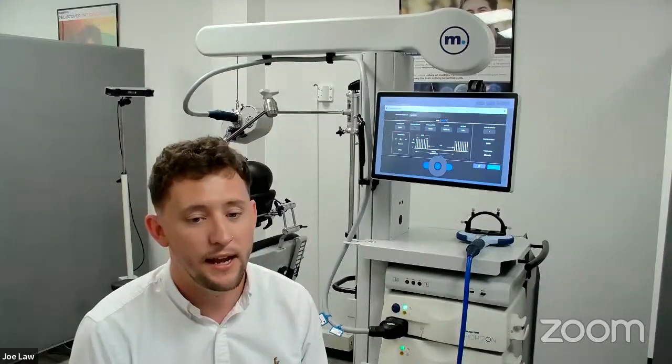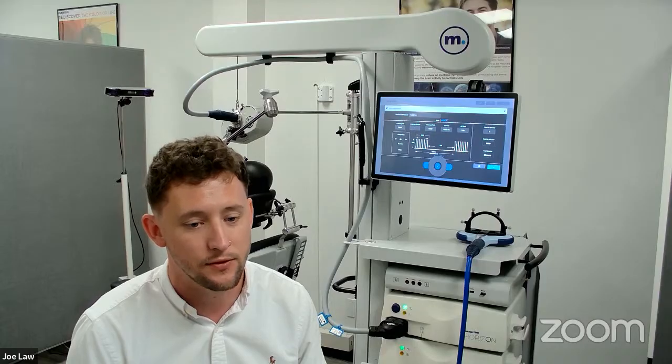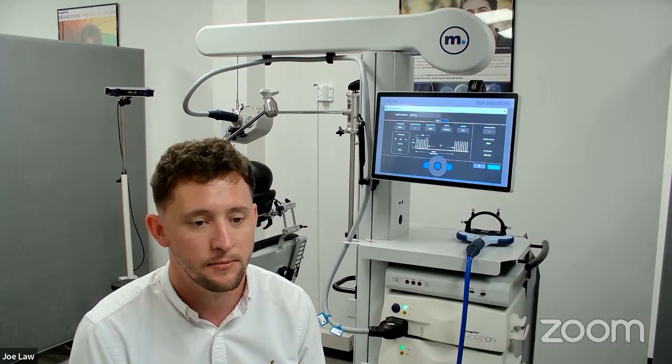We have time for one more question, team. Do you require patients to wear earplugs during each treatment? Joe, do we require earplugs? Yeah, so the FDA stipulates that you do require earplugs. Admittedly, some patients may refuse it, but the clinics themselves should be offering ear protection to the patients.